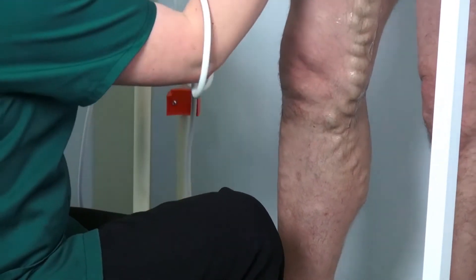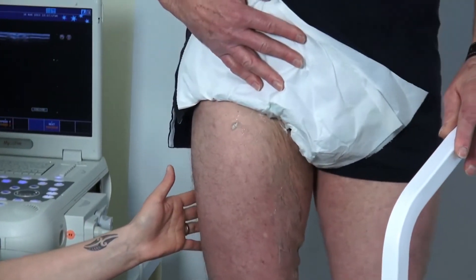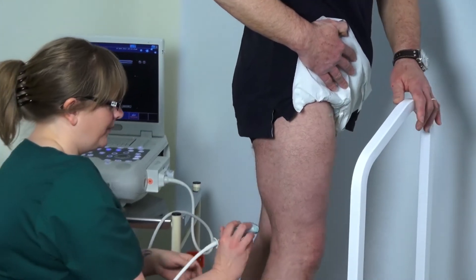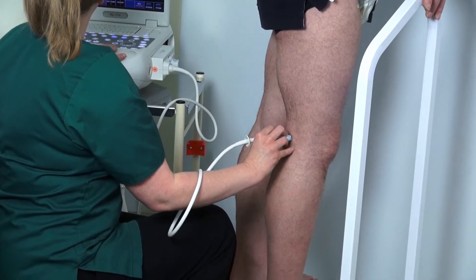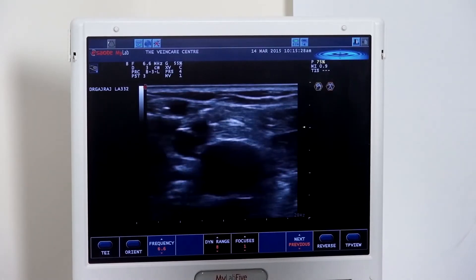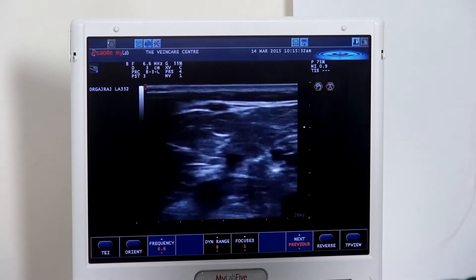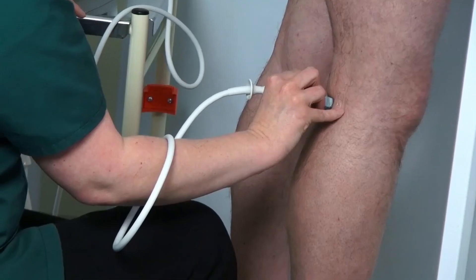The patient is asked to turn around, holding on to the bar for support. Starting in the posterior knee fossa, we bring up the popliteal vein and the short saphenous vein. Again, looking like a little Egyptian eye, you can pick that up just behind the knee crease.